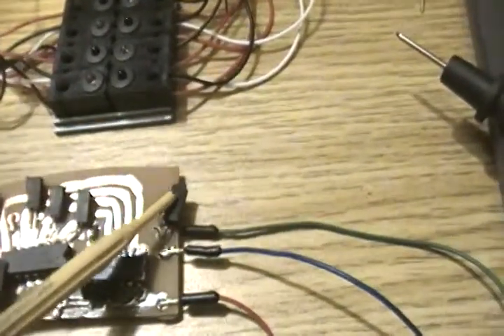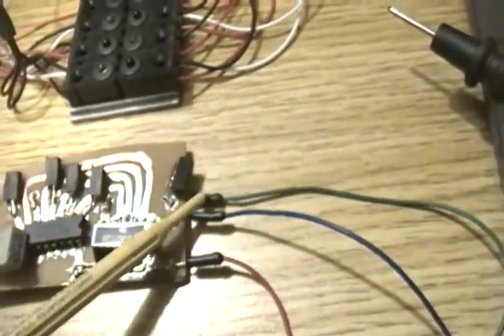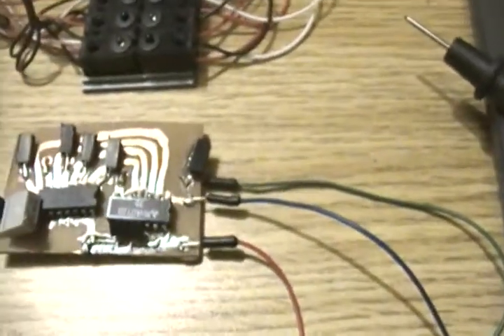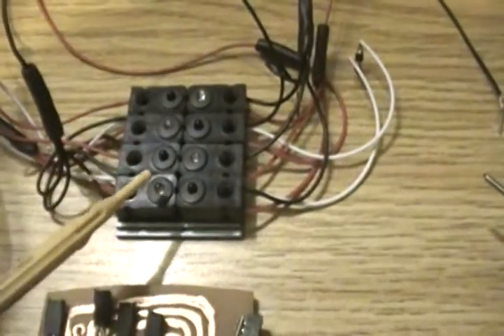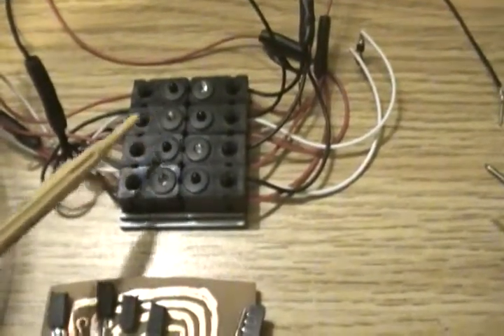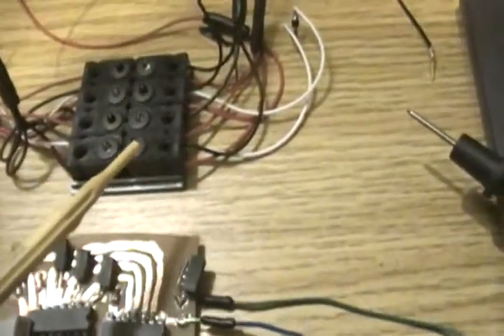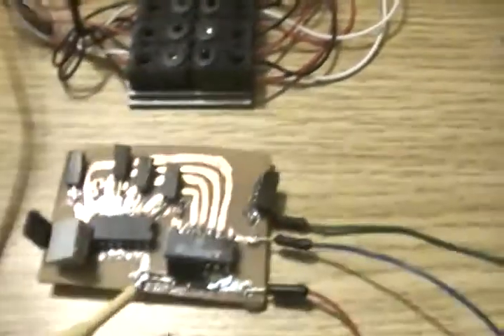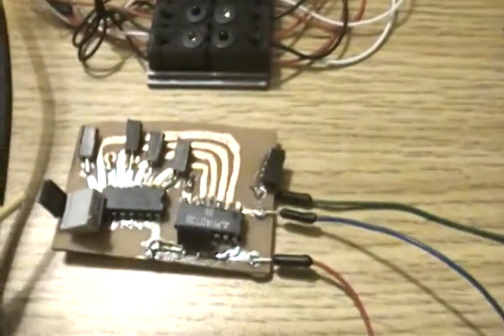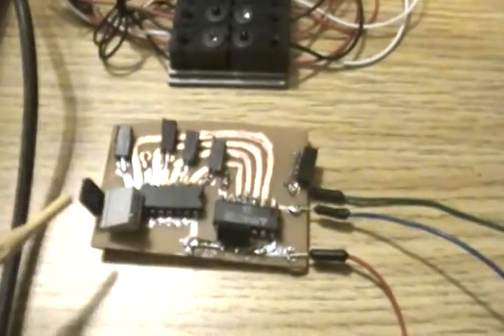And you see this little guy here has four holes and it's all connected to one green wire that is the ground for the entire thing. Now, let's look at the LEDs, 1, 2. There's one wire that goes out, and you plug it here. And the other one from the other side, from the LEDs, 1, 2, the LEDs are the clear ones, you're gonna plug them in the second hole. So this little thing here has two holes, you plug two LEDs and two LEDs.